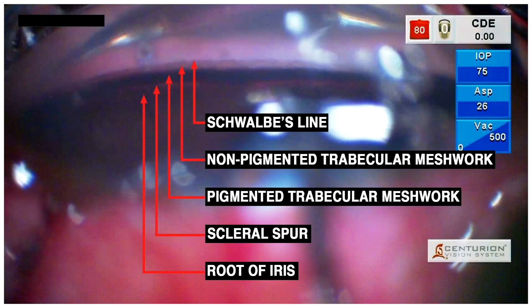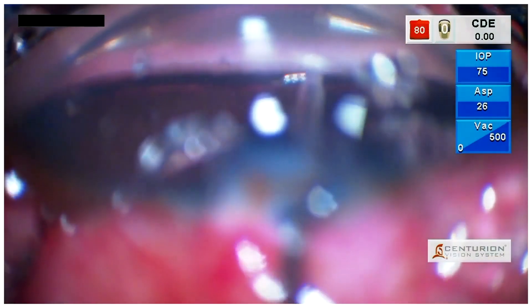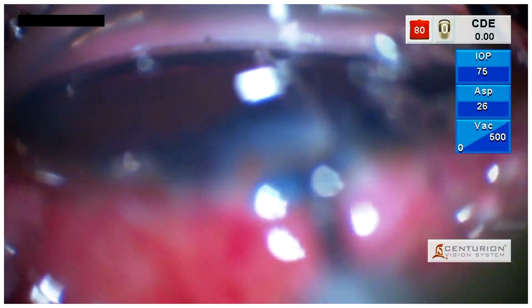Before implantation, it is imperative to identify the angle structures. Here we are implanting the G1 iStent into the trabecular meshwork with a proper gliding technique to ensure proper placement within the angle.